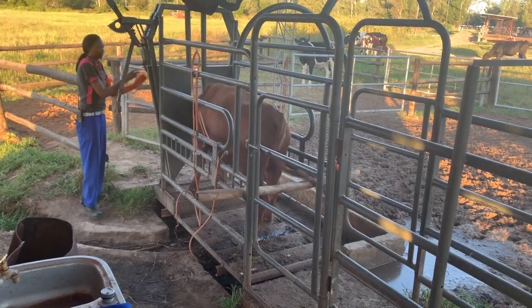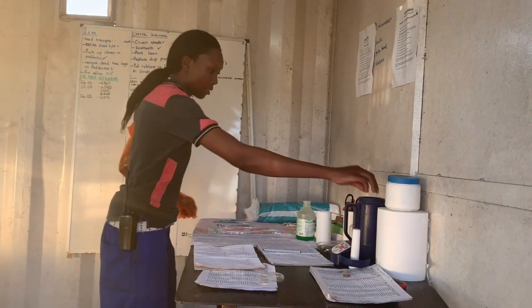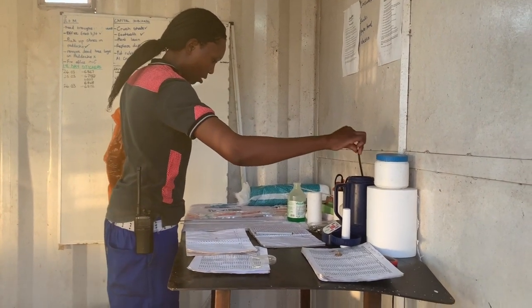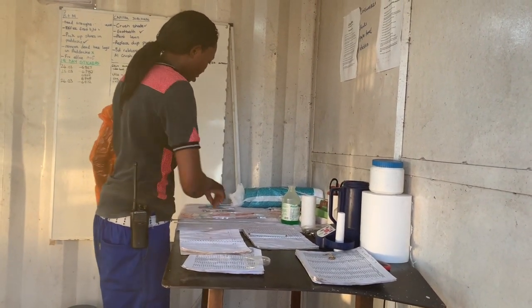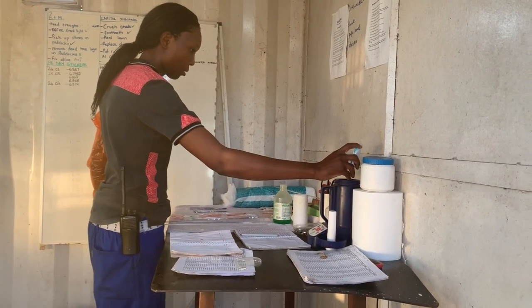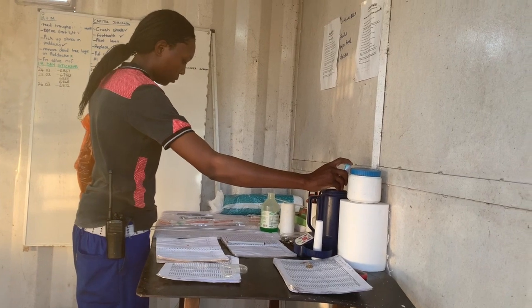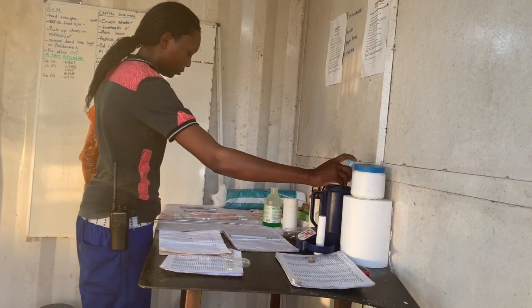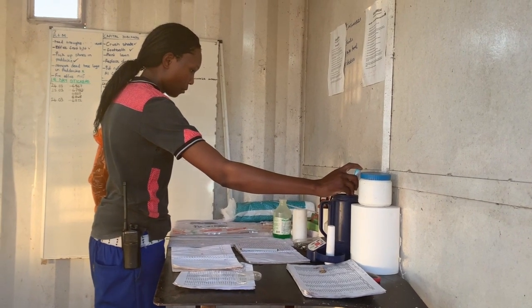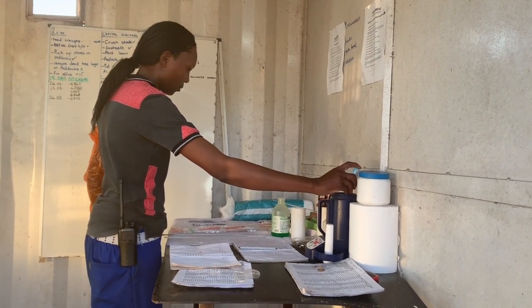Make sure for AI that you are wearing a clean arm-length plastic glove. Take the temperature of the water in the semen thawing device. It should be two degrees lower than a cow's normal body temperature, which is 38 degrees. So your semen thawing device needs to be at 36 degrees, as this is the temperature that semen would be in a bull. If the temperature is above 36, add a little cold water — as long as it's between 35 and 36, you're okay.